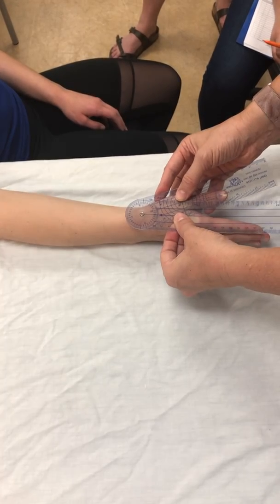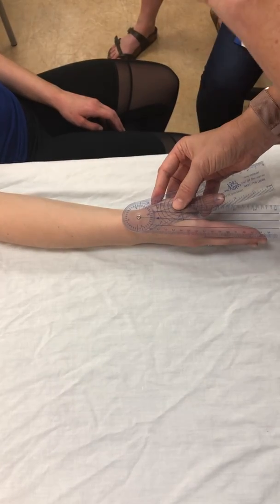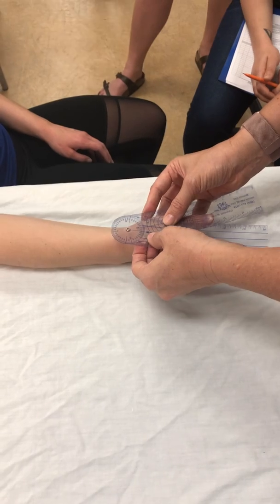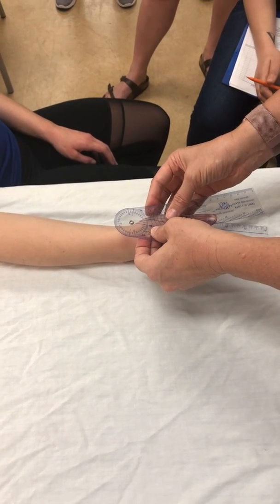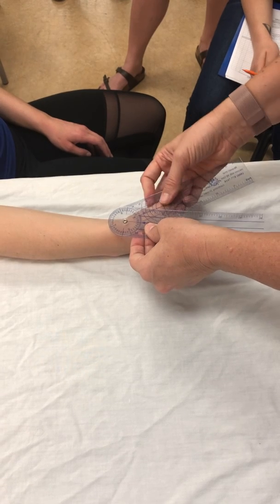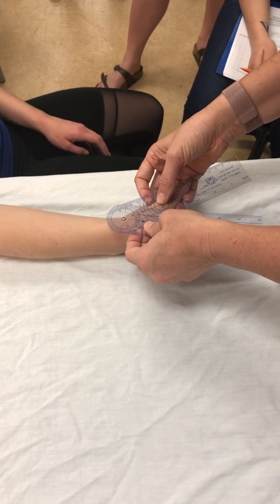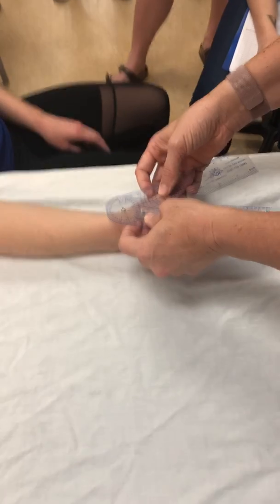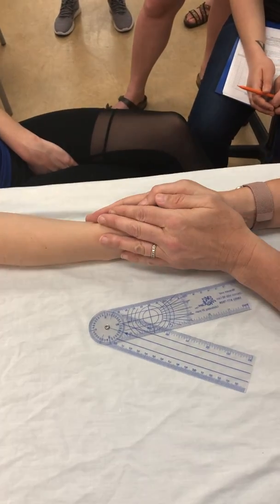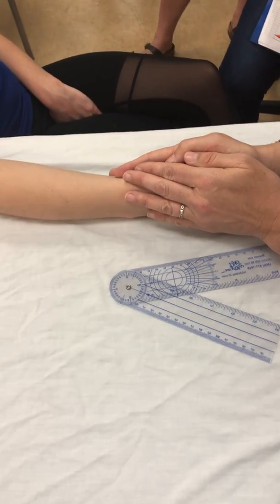Would that be 0? Well, no, we would not change our number, because now this person lacks the motion. So this person would be at 22 degrees, and then as you abducted, we would document 22 to 34. We don't change the reference point if you're lacking motion.